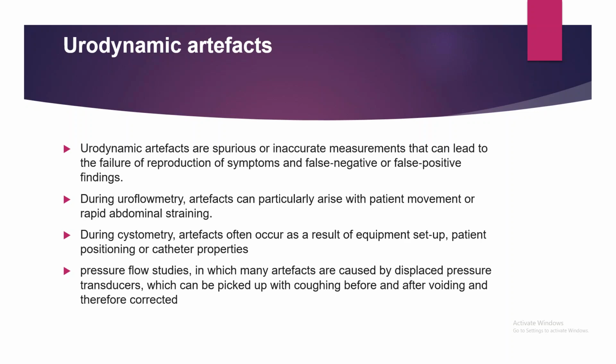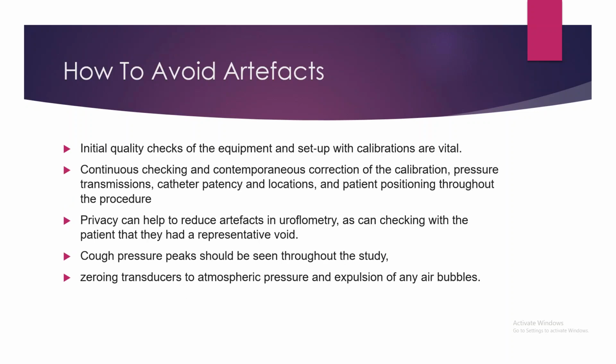So we are going to give the patient adequate privacy. We are going to tell the patient not to strain, okay? Void at your convenience, okay? And in the cystometry, we have to adjust the equipment. We have to see whether the equipment is working properly during the procedure or not, okay?